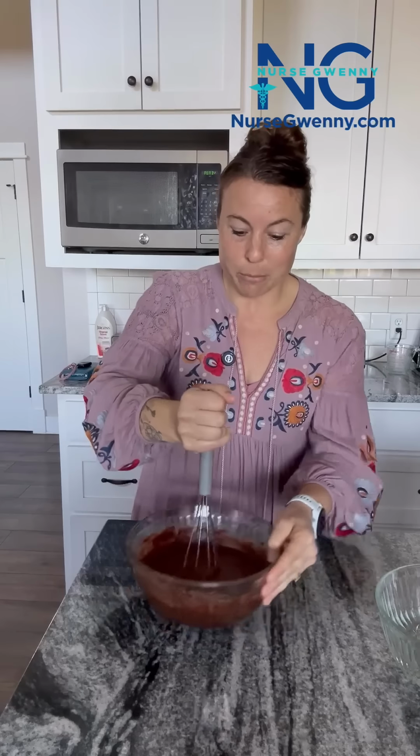Whereas when the blood starts to clot, I've got some brownie batter. I love brownies. And if I start to move this around, of course, look at how it's pulling that whisk because the brownie batter is much thicker and hanging onto it.